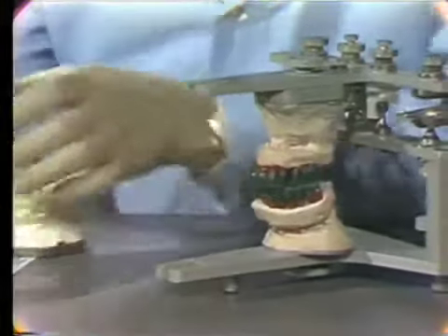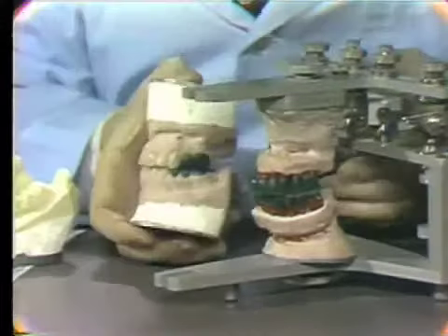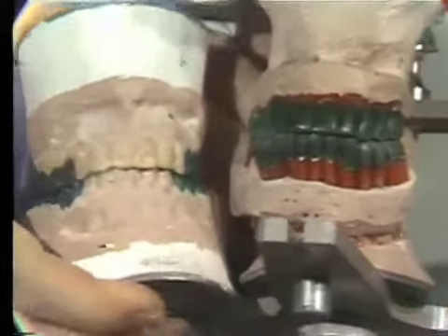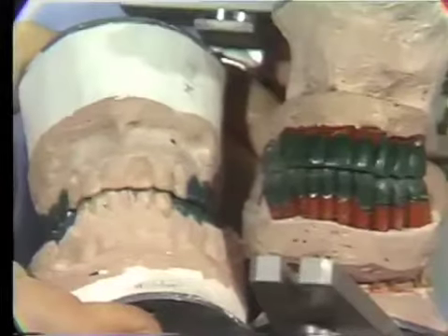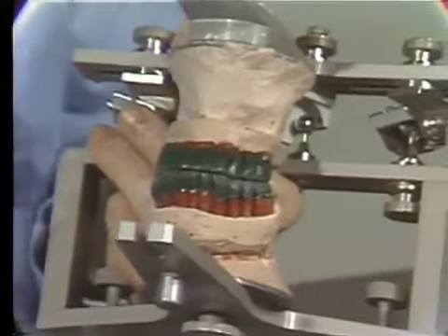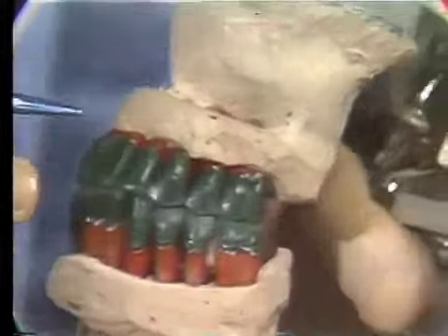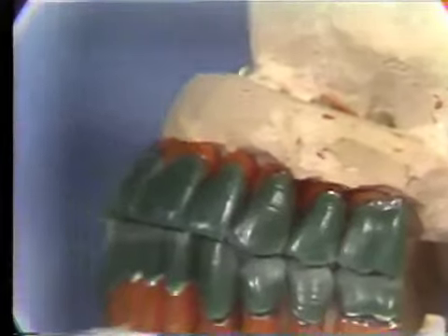We'd want a very bold masculine tooth. Also, we sent along to the lab as a guide in the wax-up, the diagnostic wax-up of the case, and this again serves as a guide to the laboratory technician on how these anterior teeth should be waxed up, and also what can be done on the posterior teeth. We'd want to check the margins, make sure that the laboratory technician has interpreted the area where the margin should be. Remember that we blacked out the area around the die, and we should take out each one of the dies.